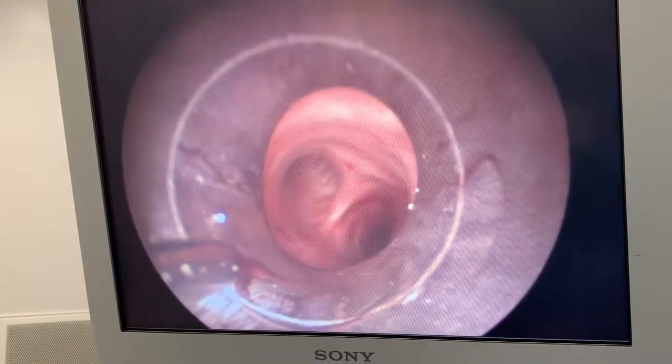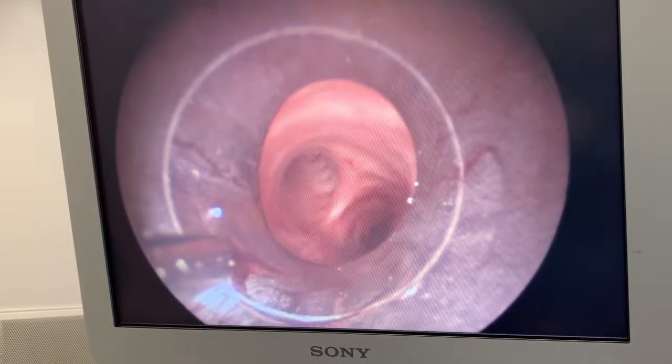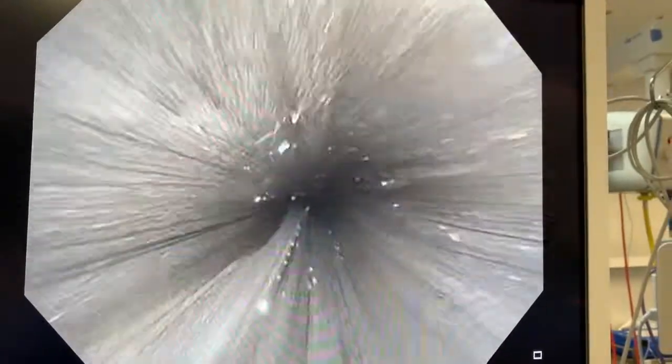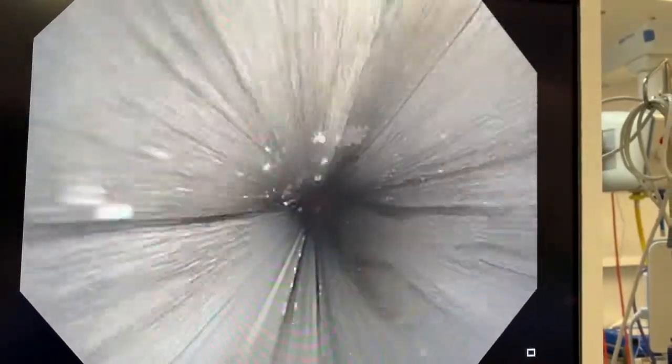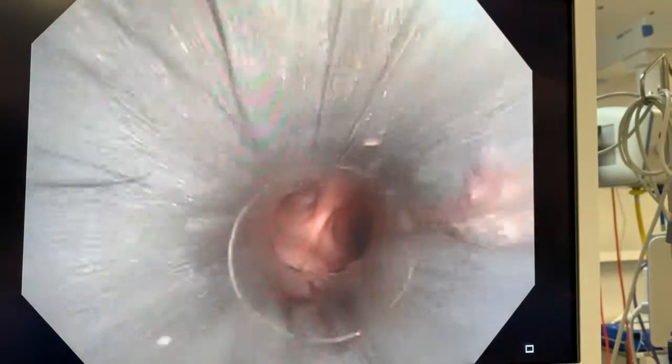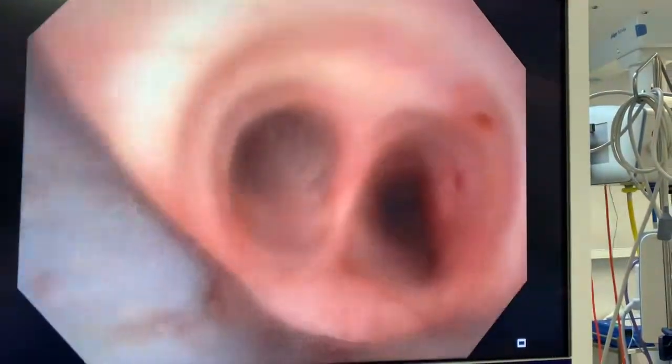Once the rigid bronchoscope is in place we can safely ventilate the patient through there. This is now the flexible bronchoscope going through the rigid scope, giving good access to the airway to allow us to biopsy that lesion quite safely.